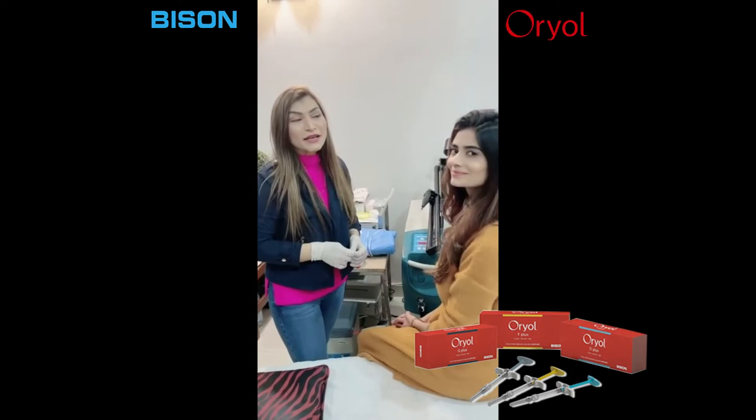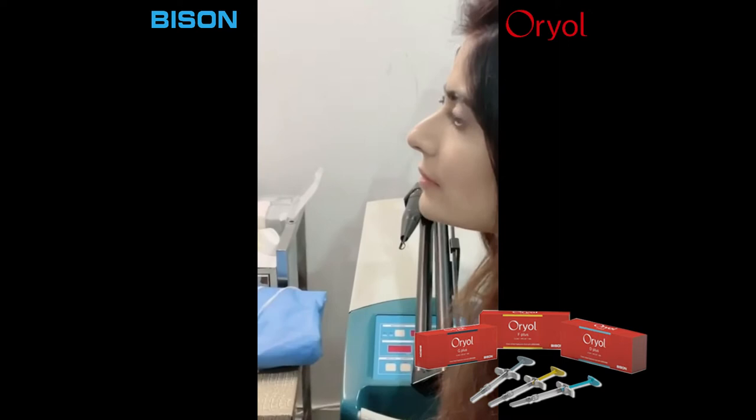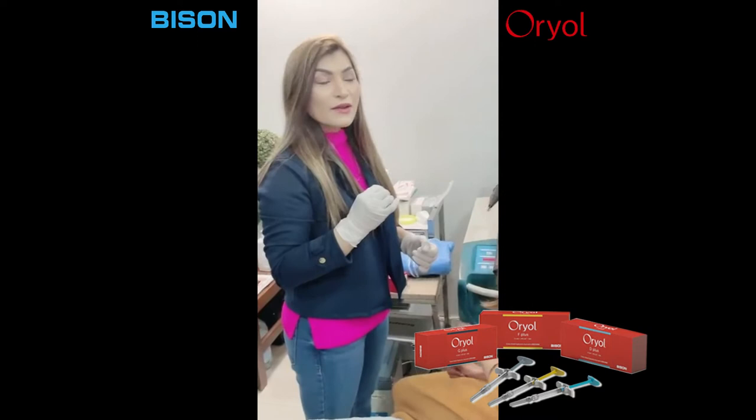She's Madiha and I just want to give her a little bit of volume for her lips for fuller, plumpy lips. She doesn't want to change her lip shape, nor does she want to give it an extra look — just a very mild kind of filler for enhancement of her features.